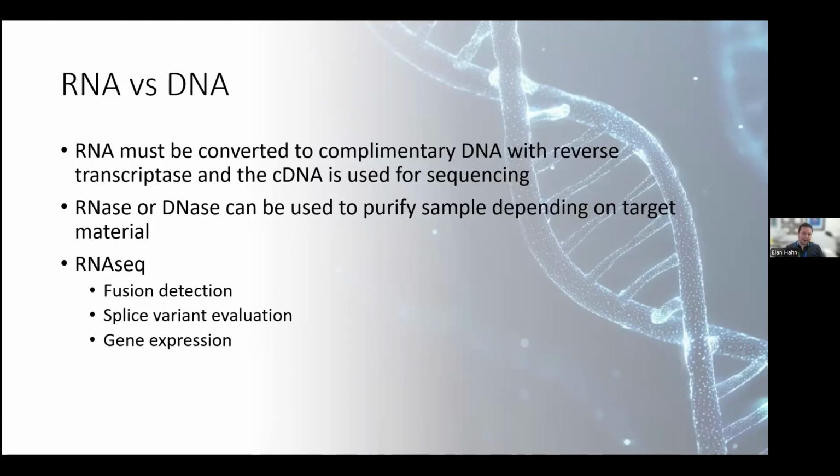Another way we could look at RNA data is by gene expression. So a highly expressed gene will have more reads or will be covered more in RNA. And typically it's not used clinically. There are some assays, like thyroid cytology NGS predictors, which actually incorporate gene expression changes into their analysis. But otherwise, in general tumor sequencing, it's not typically used.